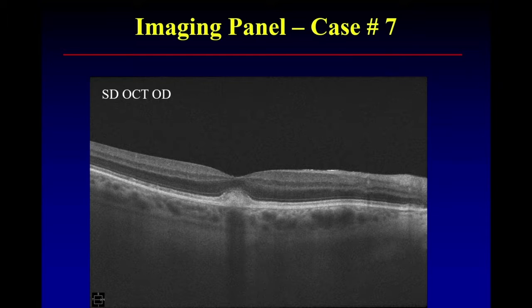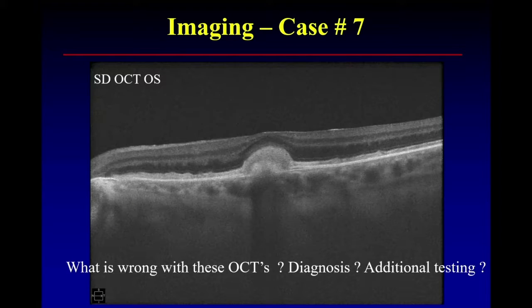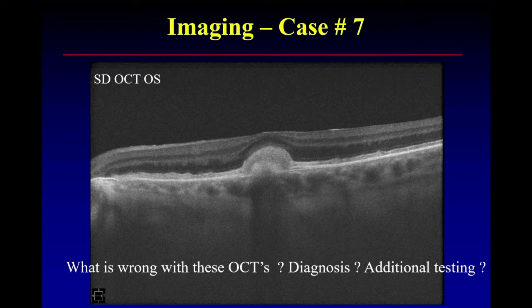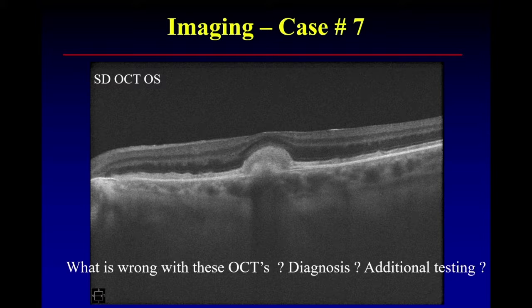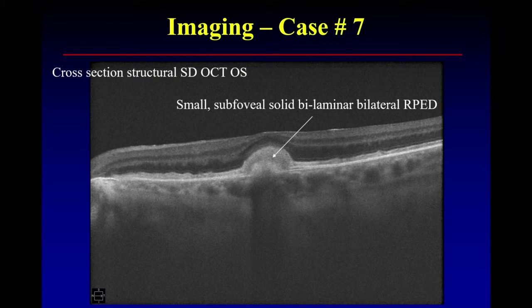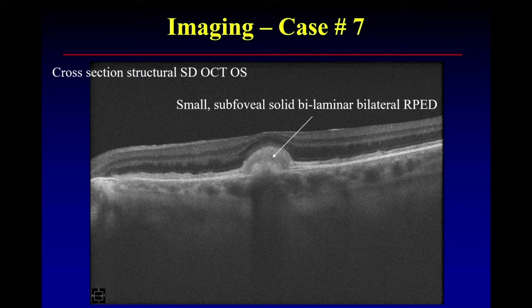On to case seven. Mike, I'm going to show you a right eye and a very similar-looking left eye and ask: what's wrong? Well, under the fovea there are these sort of vitelliform or elevated lesions. Are these pathognomonic of a disorder, and do you need additional testing? Nothing pathognomonic is coming up yet. We've got these bilaminar, bilateral, solid-appearing RPEDs — does that bilaminar nature strike anybody as characteristic of pattern dystrophy, adult-onset vitelliform?